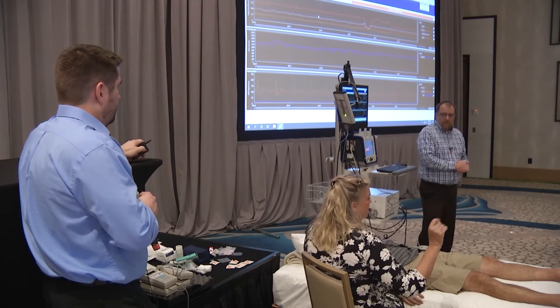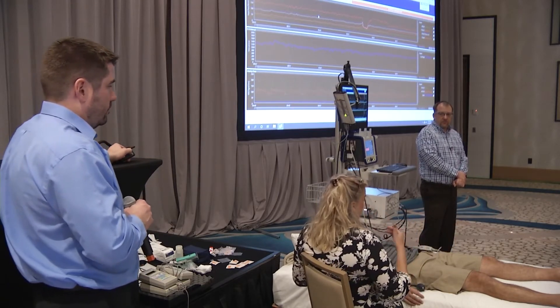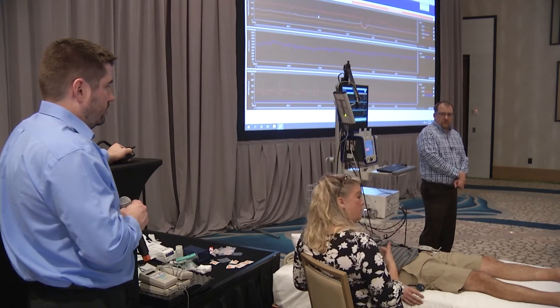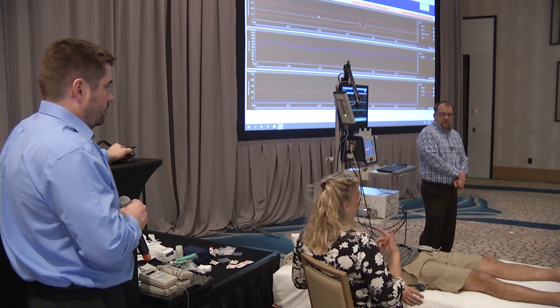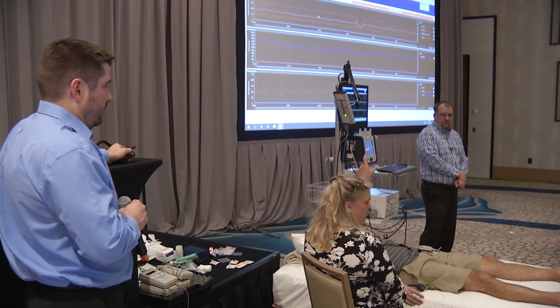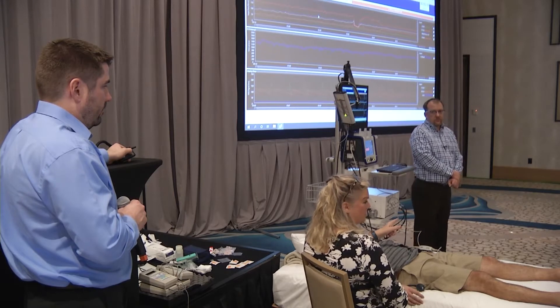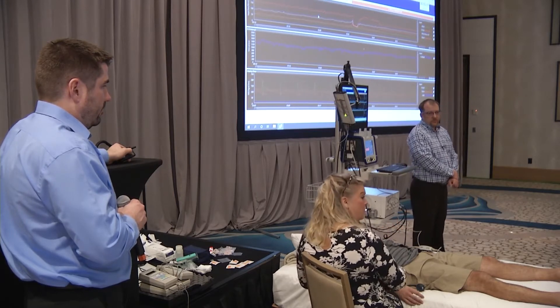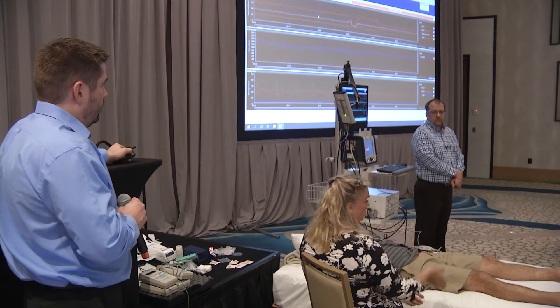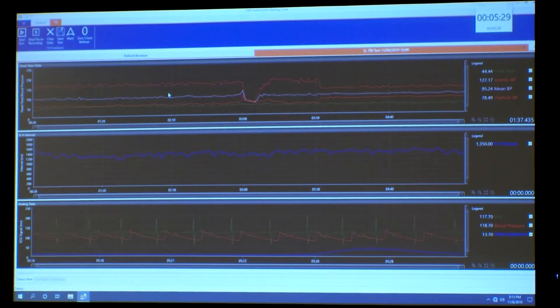It's important that both technicians understand blood pressure patterns equally. If one is taking blood pressures and the reading is 60 over 40 with the patient looking pale but without symptoms, the other technician needs to recognize that pattern too. They also need to know when to make the decision to lower the table — if they see the heart rate and blood pressure drop, they need to be able to act.